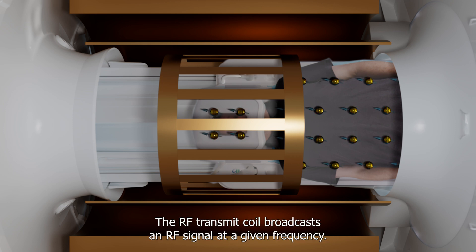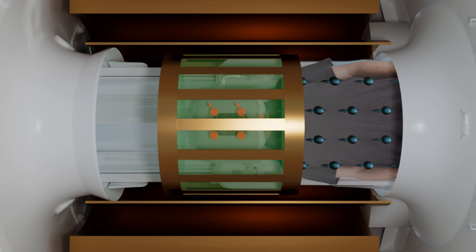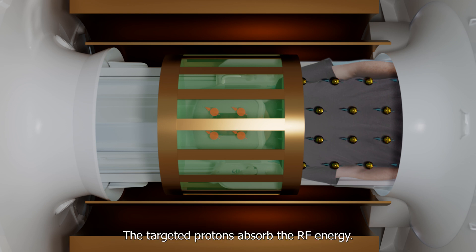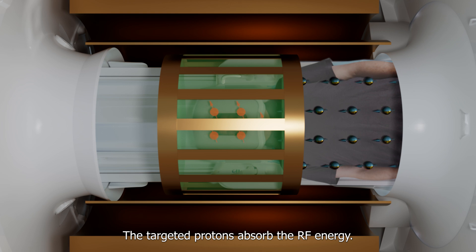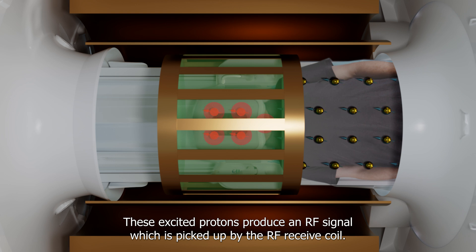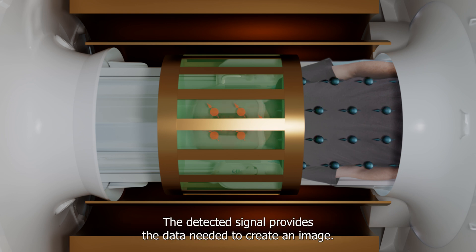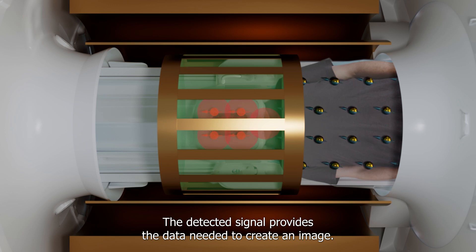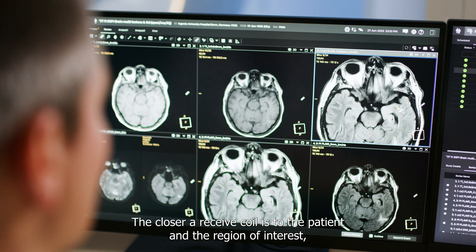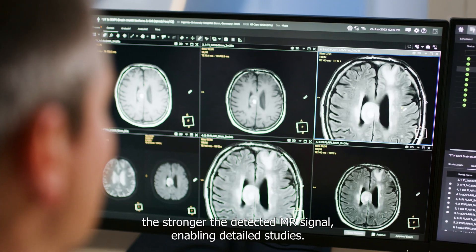The RF transmit coil broadcasts an RF signal at a given frequency, known as the resonance frequency. The targeted protons absorb the RF energy. These excited protons produce an RF signal which is picked up by the RF receive coil. The detected signal provides the data needed to create an image. The closer a receive coil is to the patient and the region of interest, the stronger the detected MR signal, enabling detailed studies.